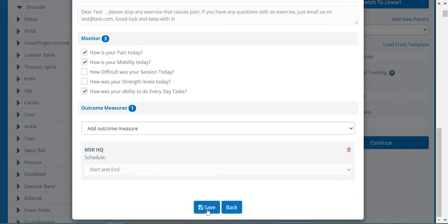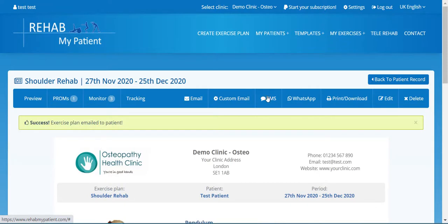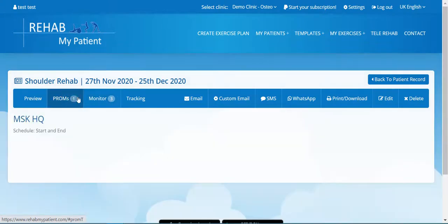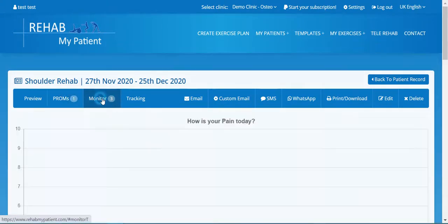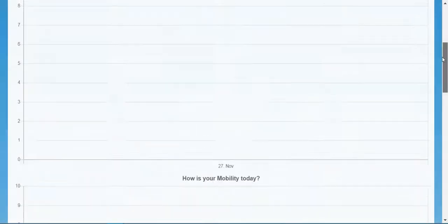Press save, then simply click to email it to the patient — you can also SMS it — so they can track their progress. You can look at the results by clicking on these options. You'll be able to see the scores from the MSK HQ or monitor the various charts you asked the patient to fill in.